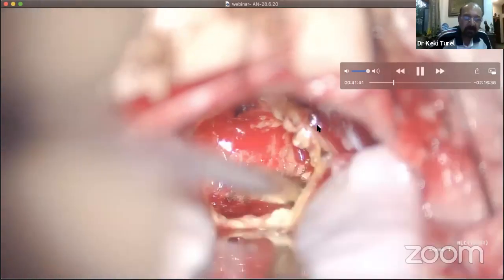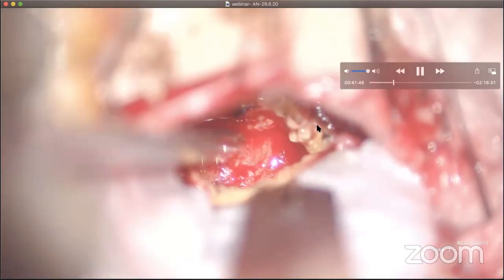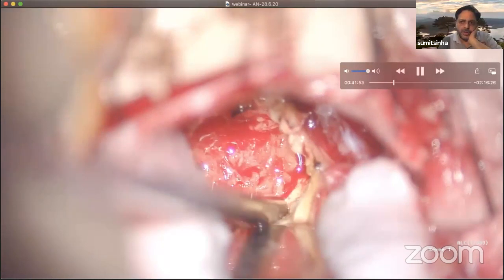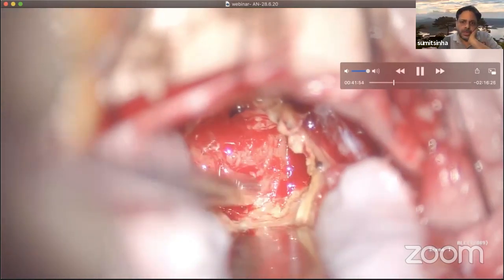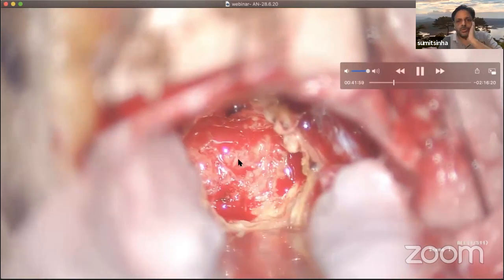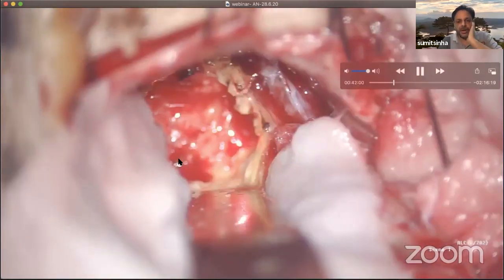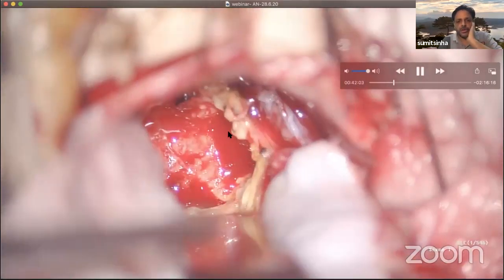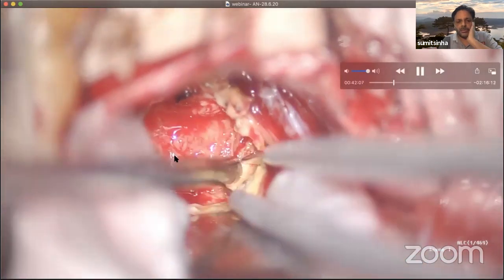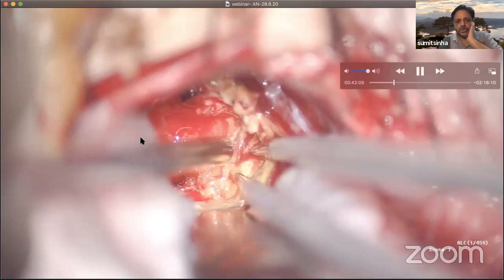Any specific pattern of dissection you follow? Yeah, this is a good question. It depends on my personal choice. My personal choice is to decore the central part of the tumor first, and then go on to decore the lower part, and then come to the medial part, and then go to the upper part.